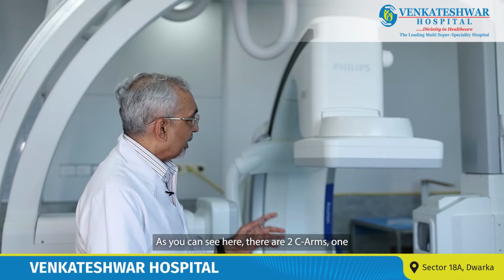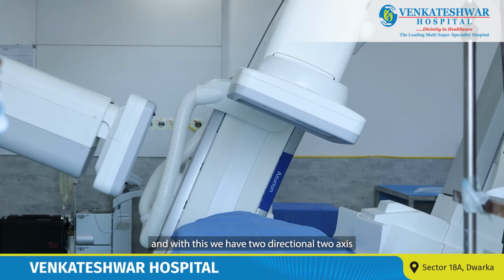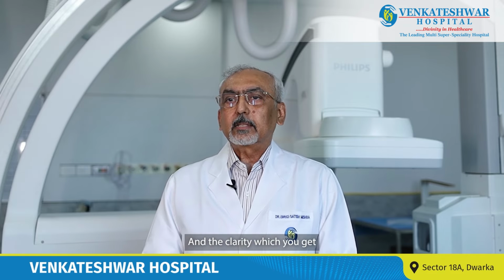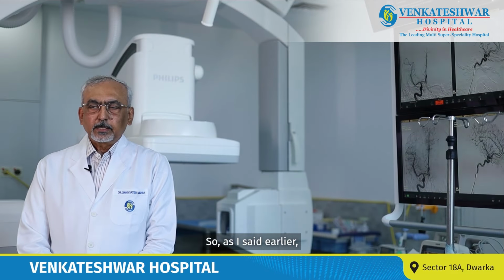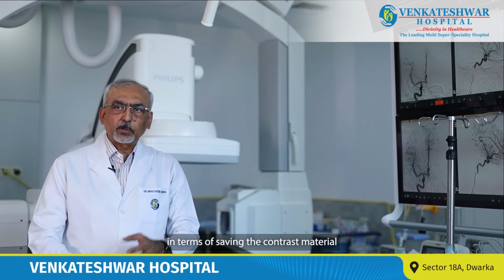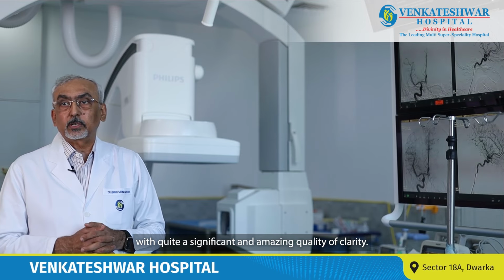As you can see here, there are two C-arms, one which is hanging right from the roof and the other which is placed down here. And with this, we have two-directional, two-axis acquisition of the images which the detectors tend to pick up, and the clarity which you get is wonderful, exceptional, and in a very, very short time. So as I said earlier, the Bi-Plane Cath Lab affords you an advantage in terms of saving the contrast material, and it can take images in two axes with quite a significant and amazing quality of clarity.